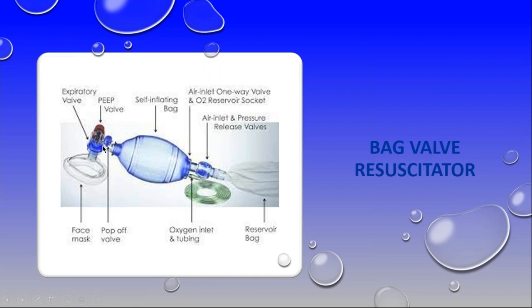There's your PEEP valve or your pop-off valve. Very often, when I enter into resuscitations, I hear this bip, bip as people are bagging. If you hear this pop-off valve making a noise while you're bagging, you are doing harm because it is far too hard. This should not happen. This bag needs to be filled with oxygen.